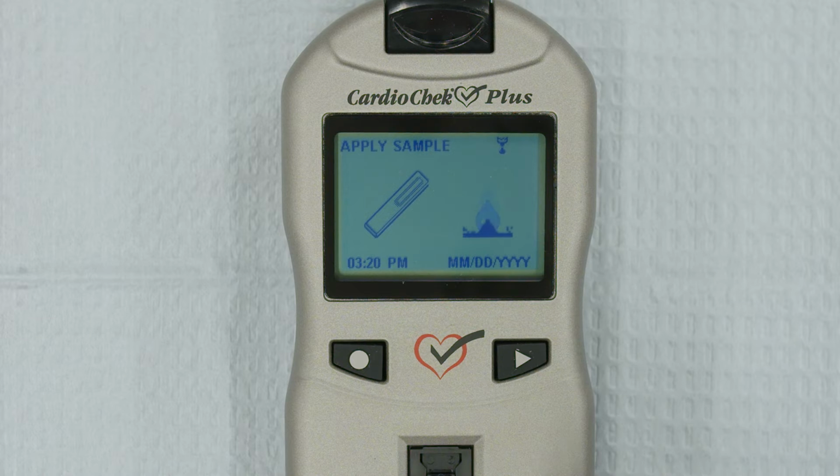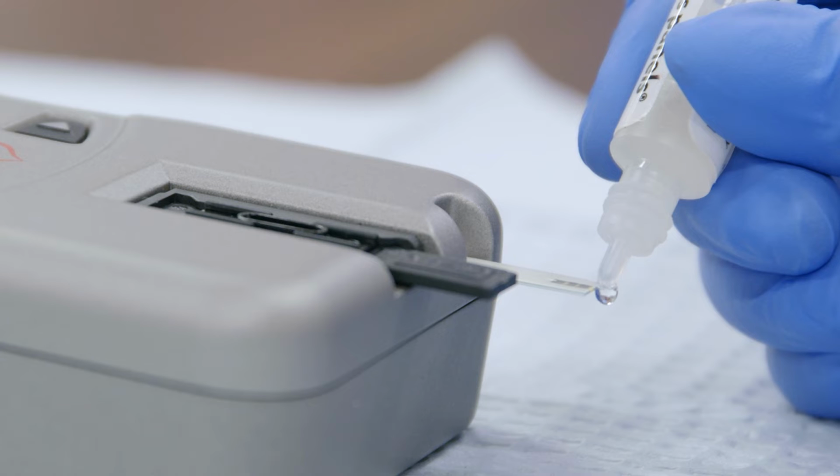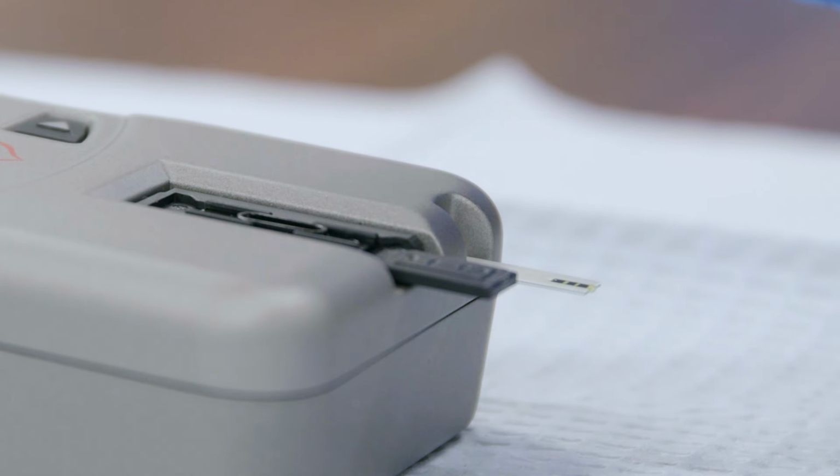Start by inverting the level 1 control vial 4 to 6 times to mix the solution. Then remove the cap, turn the vial upside down, and hold the tip of the vial directly in front of the tip of the eGLU test strip. Do not touch the vial to the strip. Carefully squeeze the vial to deliver 1 drop of control solution to the tip of the electrochemical test strip.